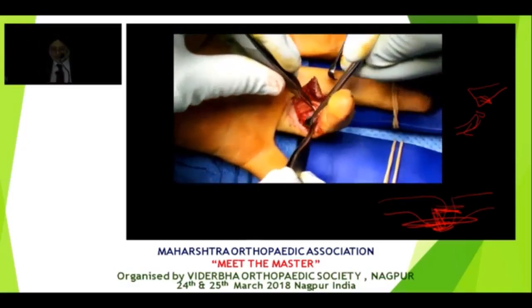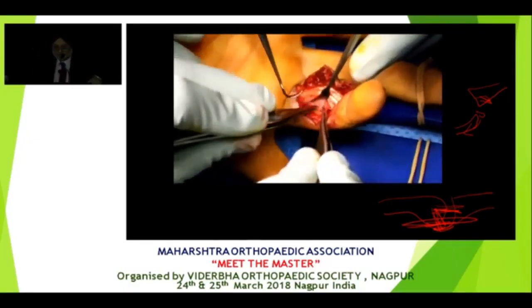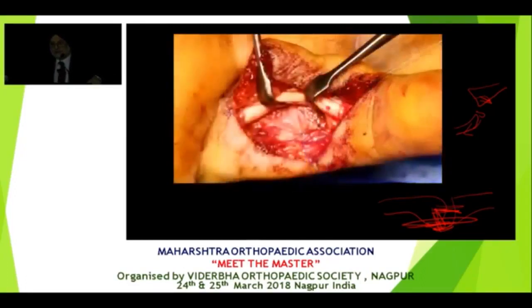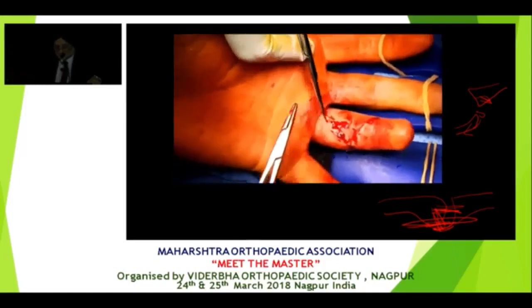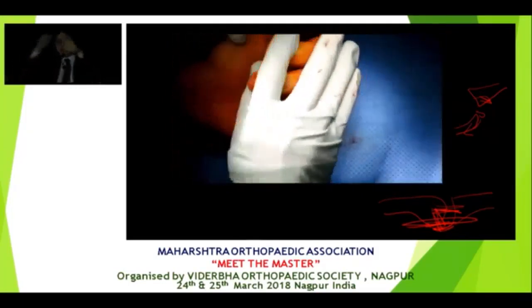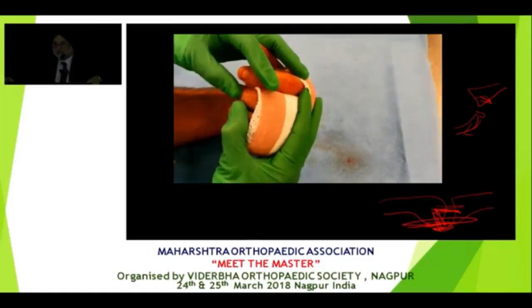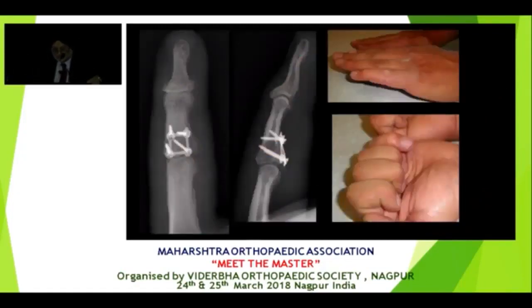So now I'm pulling the tendon sheath over the plate, under the tendons. And we're going to stitch it down over there. So there's no metalwork exposed to rub on the tendons. Patient is allowed to actively mobilize. We only give him a splint to stop him hyperextending, but they allowed full range of motion. So this is the dressing post-op, just a soft dressing so patient can actively start movement. And here is the patient 3 weeks later, and you can see he's already getting back his movement, and that's what the plate looks like.